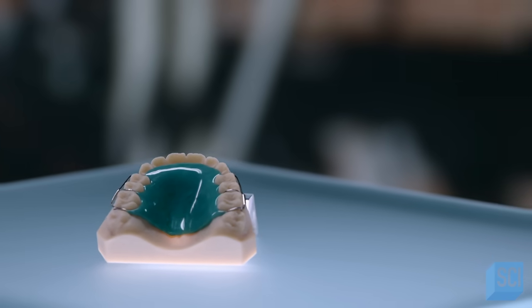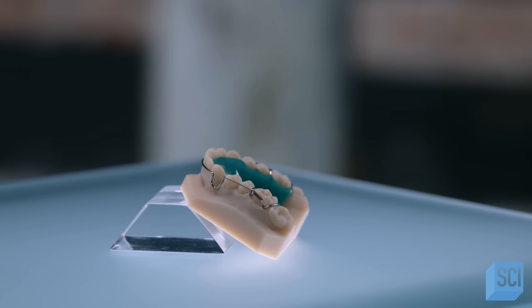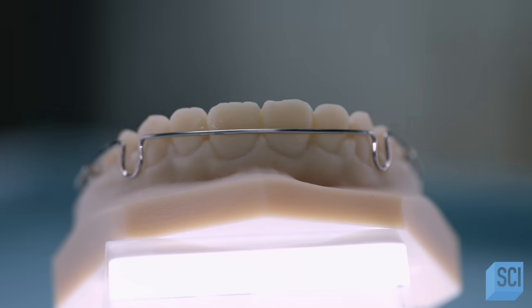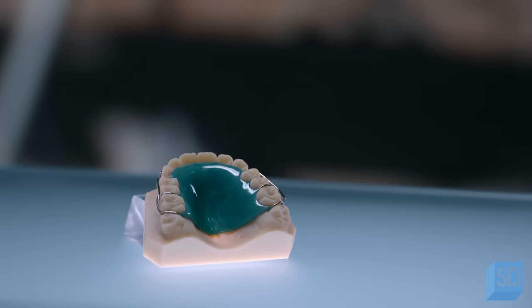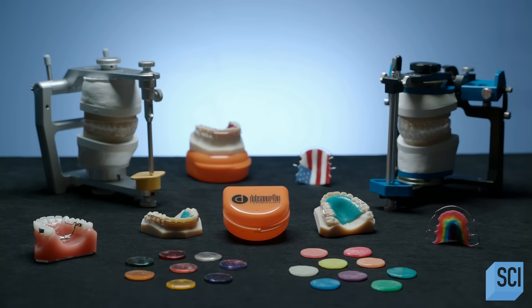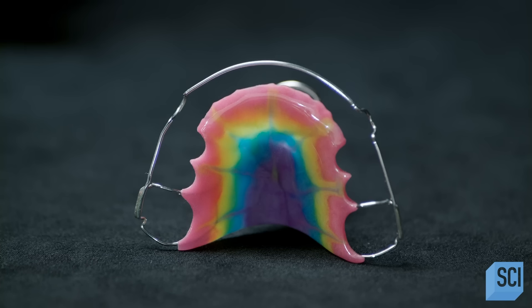After spending a fortune on braces to straighten your teeth, you don't want that new beautiful smile to shift back to its original position. So orthodontists recommend wearing a retainer for several months after the braces come off to avoid any shifting. Oftentimes an orthodontist advises their patients to wear a retainer for about a year after their braces are removed.